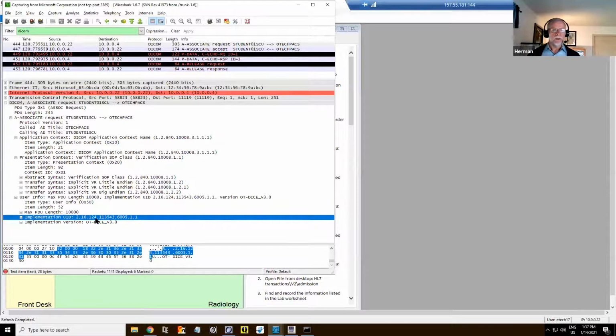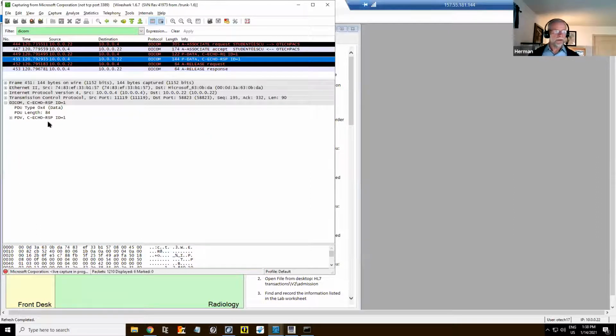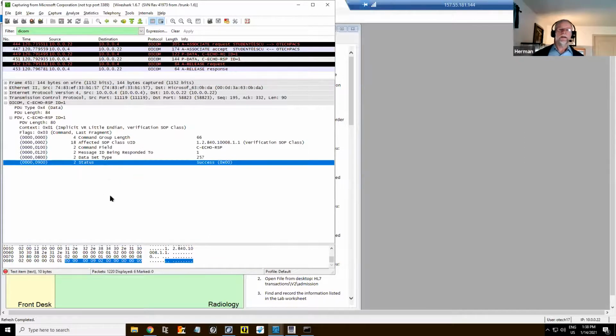Okay. So what is important, remember when you look at a communication, there are 2 critical junctures: whether information is accepted or not, right here. And was it accepted? Yeah, it was accepted. Otherwise it would say reject. So basically it was accepted. And in my C-echo response, the status code, my status: success, 0. So everything was fine. Very simple.